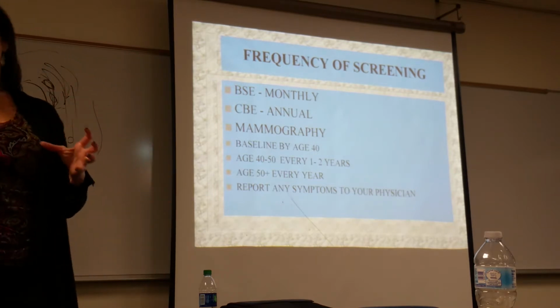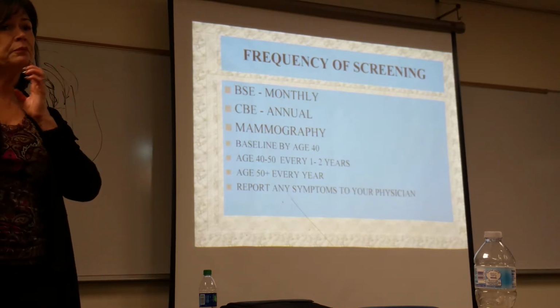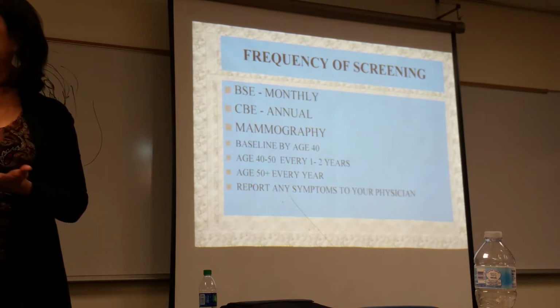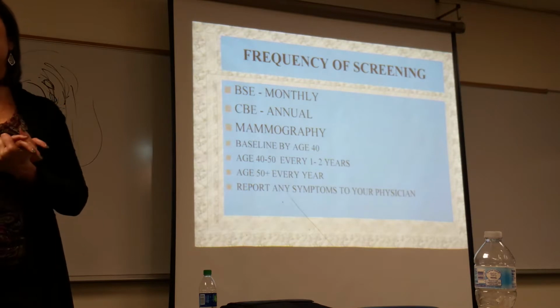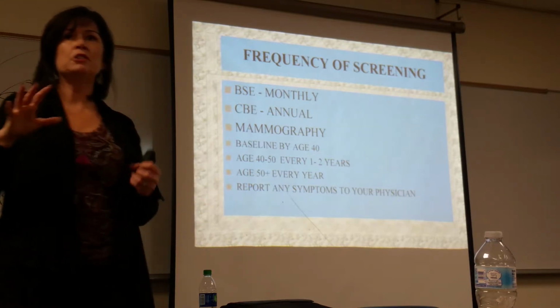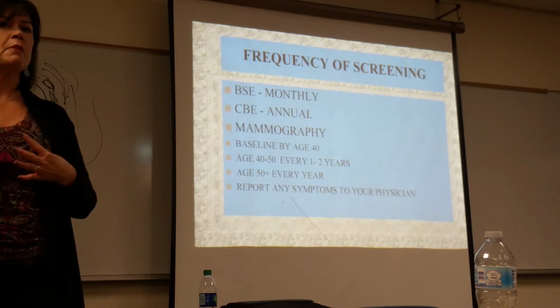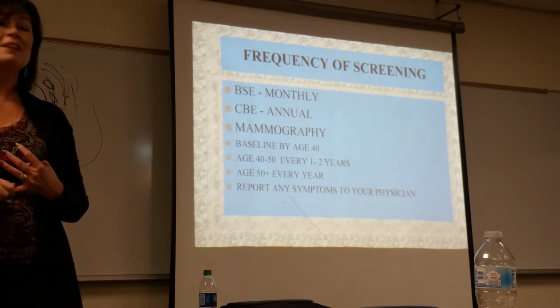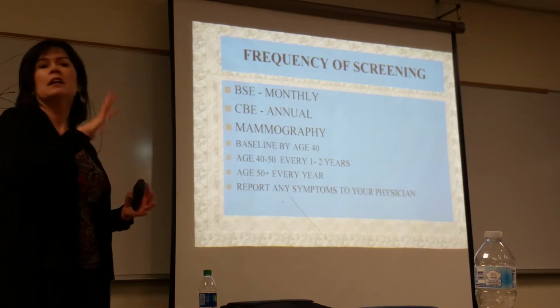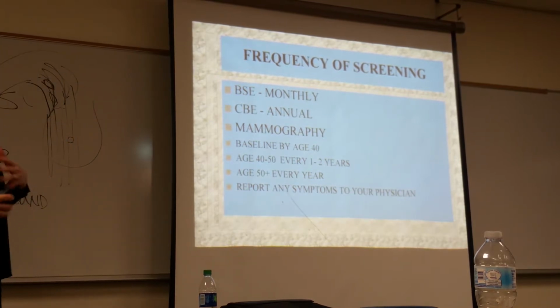So that was just the way it was with mammography. Using xeromammography, it was paper that we used, and I'm not going to go into that, it's long gone. But the exposures were so high, and that contributed to some of the concerns about using radiation on the breast tissue. Now we're in digital mammography, doses are low and quite different, and I'll show you some comparisons.